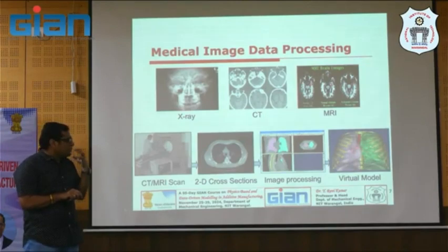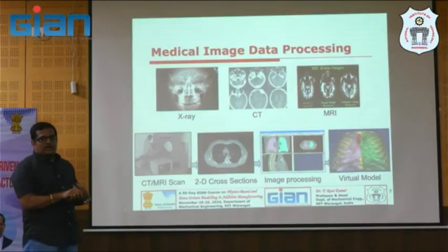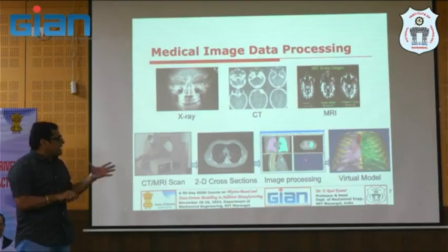In that case, you may not be bothered at this point about the ribs or the spine. So you are going to segregate the lungs, that is soft tissue, with respect to other surrounding tissues, right? Then you can adopt any medical image processing tool for that.